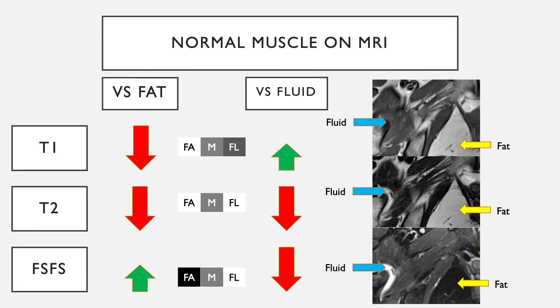What is normal muscle on MRI? We contrast it with fat and fluid. On T1 weighted images, fat is bright, fluid tends to be slightly dark, and muscle sits somewhere in between the two. On T2 weighted images, both fat and fluid are bright, and muscle is slightly darker.